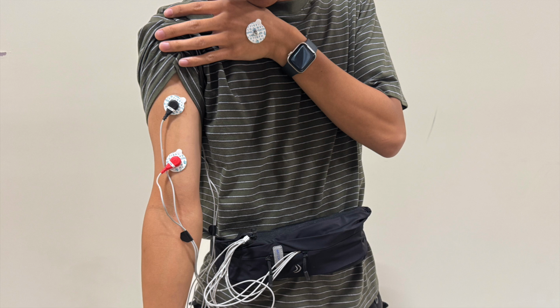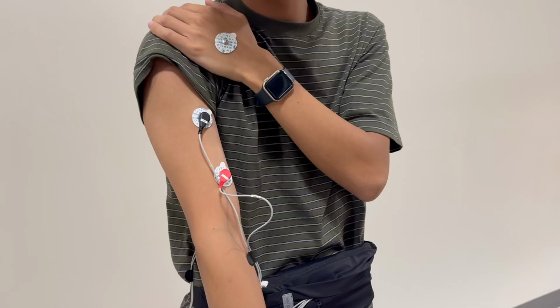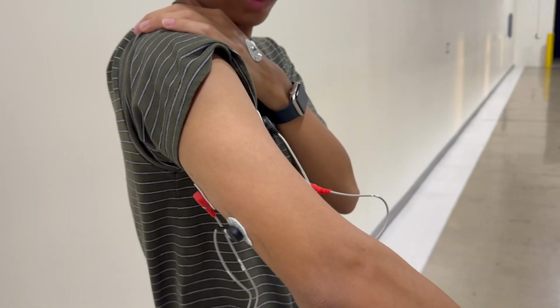Users may select either one or two channels for simultaneous recording over the full trial duration. Alternatively, a split mode allows the use of 2 or 4 channels, where the system records from half of the channels during the first half of the trial and switches to the remaining channels for the second half. This allows analysis of multiple muscle groups or alternating limbs, such as during single leg balance or fatigue studies.